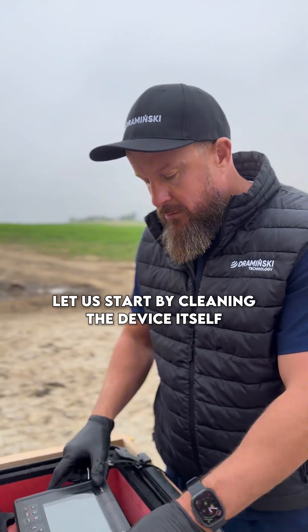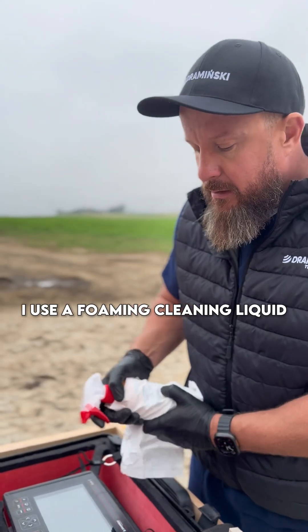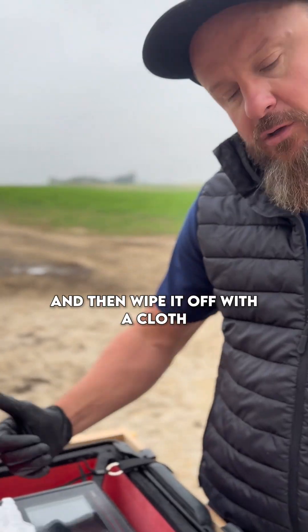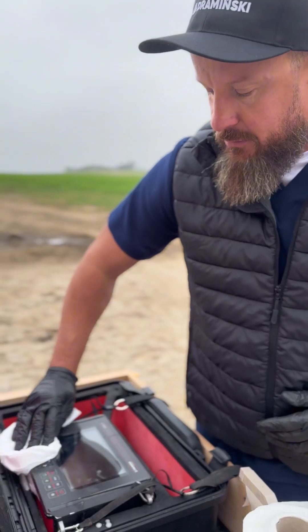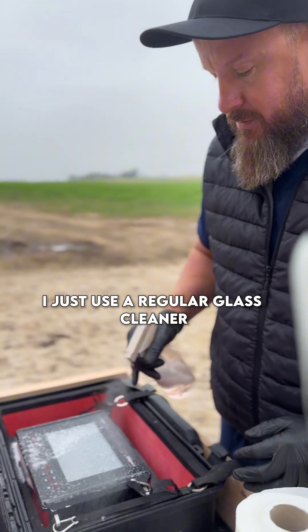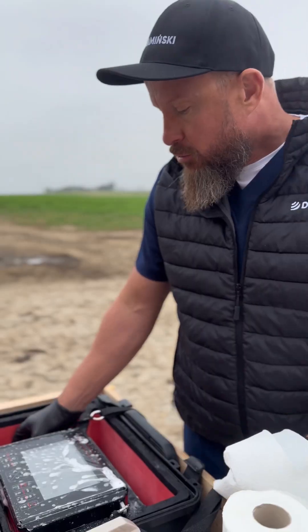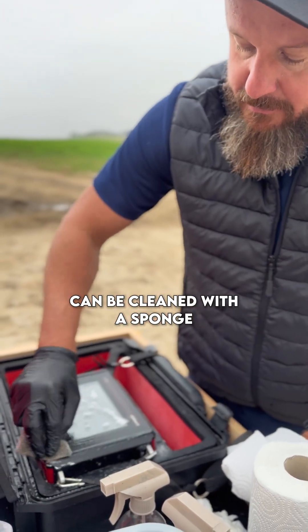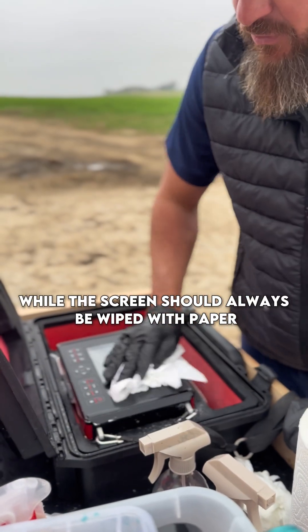Let us start by cleaning the device itself. I use a foaming cleaning liquid. Leave the foam on for a moment so the dirt softens, and then wipe it off with a cloth. If the device is not very dirty, I just use a regular glass cleaner. The parts that are not the screen can be cleaned with a sponge, while the screen should always be wiped with paper.